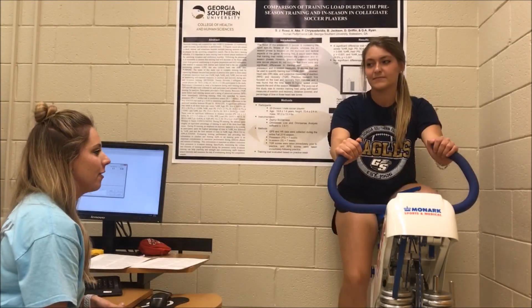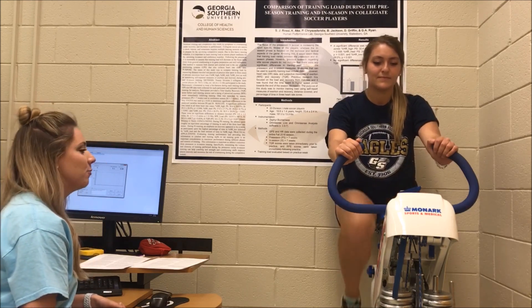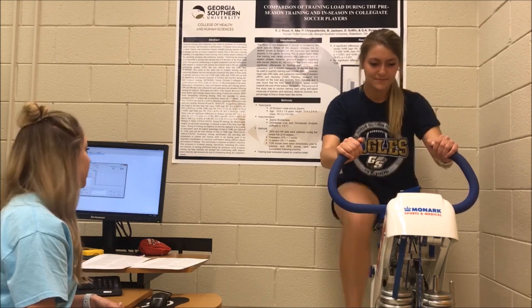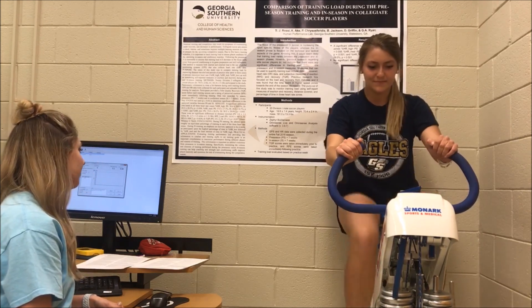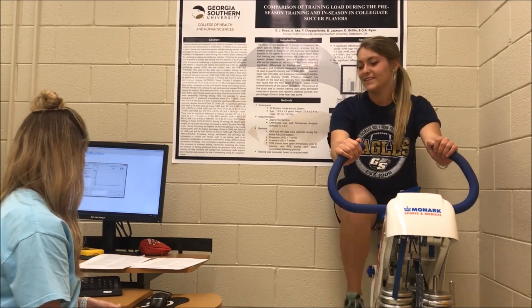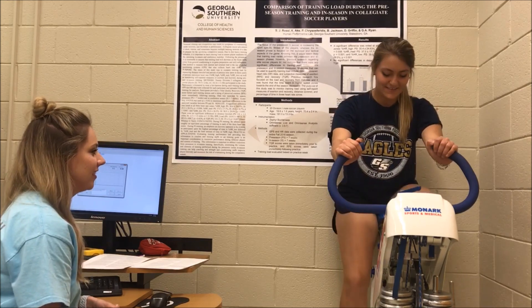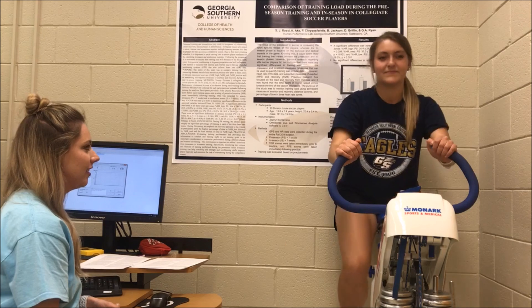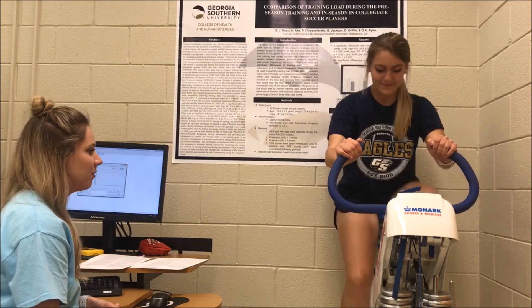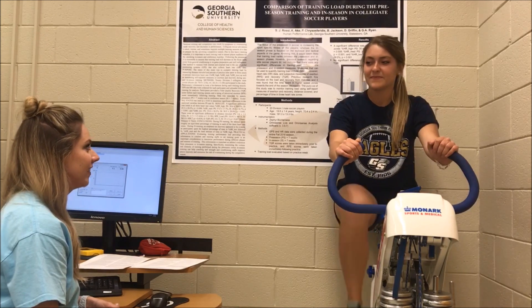Preparing for your fourth all-out sprint for 4 to 6 seconds. 3, 2, 1, go. 4, 3, 2, 1. And prepare for our final sprint. 3, 2, 1, go. 4, 3, 2, 1. How are you feeling? Feeling good still.